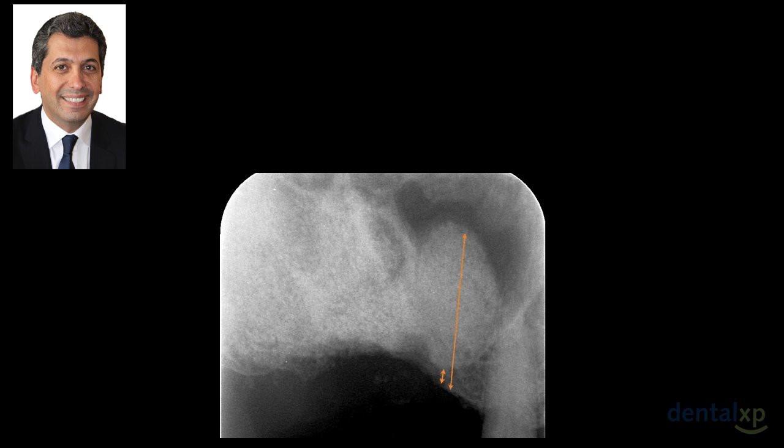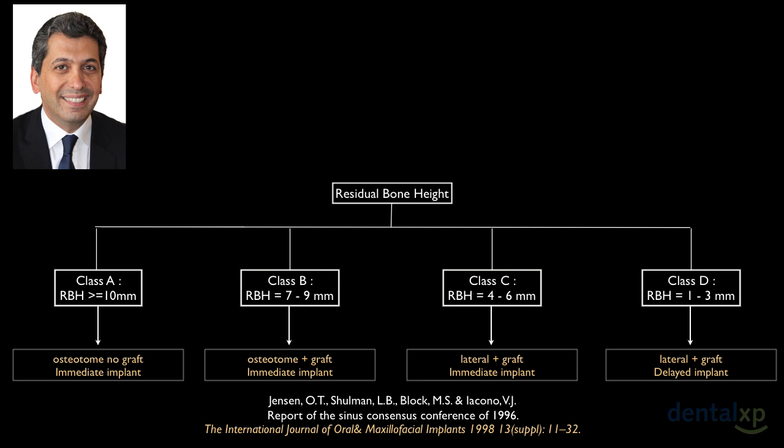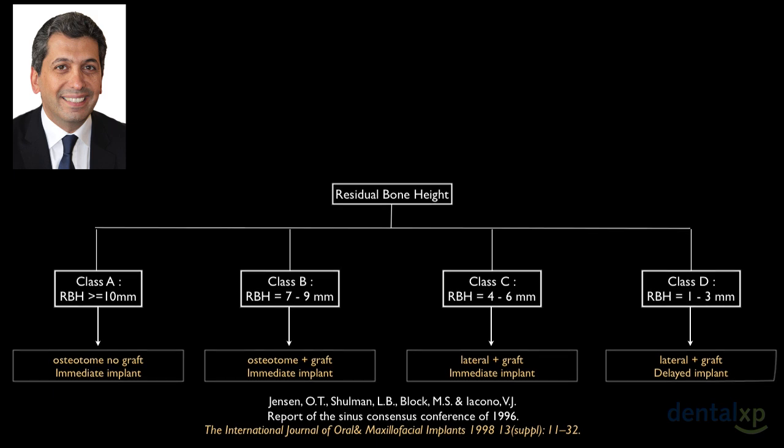So you can see that today, when we go back to this sinus consensus conference, we can see that there are no boundaries to any technique. What was true years ago is not true anymore. This consensus conference can be obsolete today, and this is why we will try to give our treatment options whenever we do a sinus floor elevation.